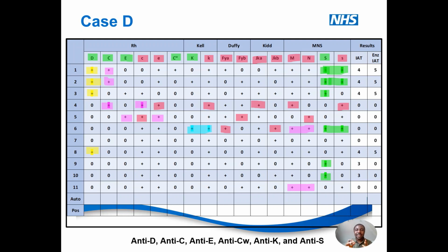So let's look at this case D. In this case D, you are going to see that obviously this enzyme, because I'd already given you the information, so I'm going to be quick. This enzyme obviously matches anti-D. So we know that there is anti-D here. Okay. But look at big C. We are not able really to exclude big C.